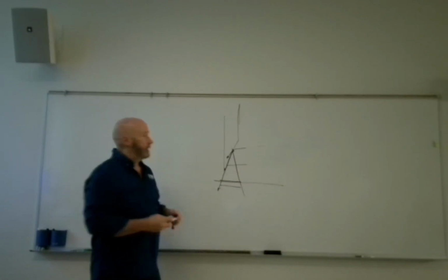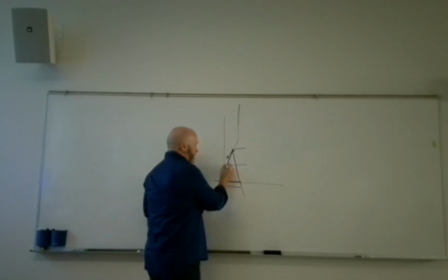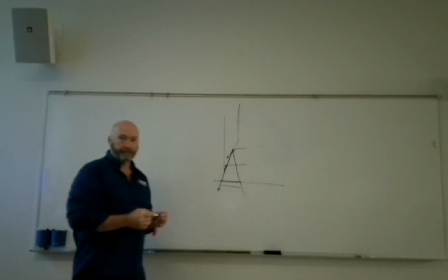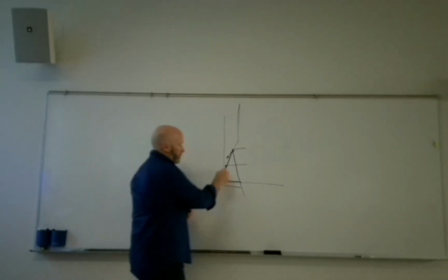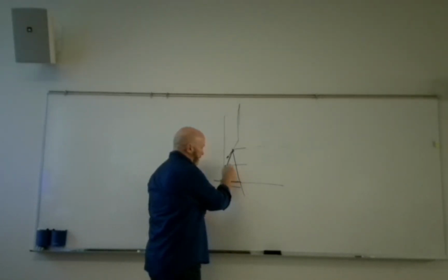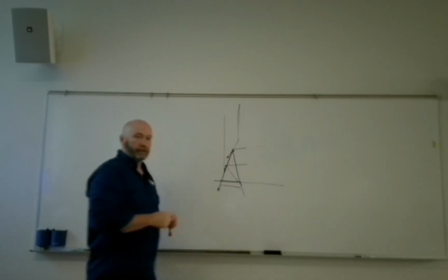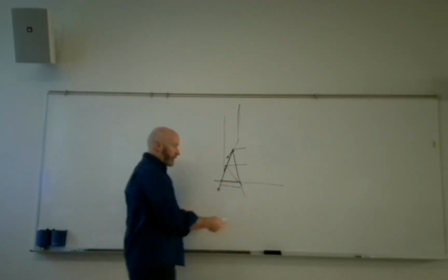Right? Then we're going to have also, let's say our focal track ends right there. We're going to have X-rays that are created here, and those are also going to exit this end of the window. Right? We're going to have some that are created here, and they're going to exit that end of the window. True? And then all the way across.